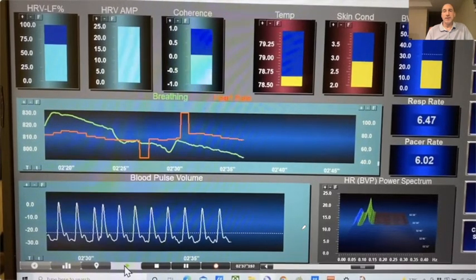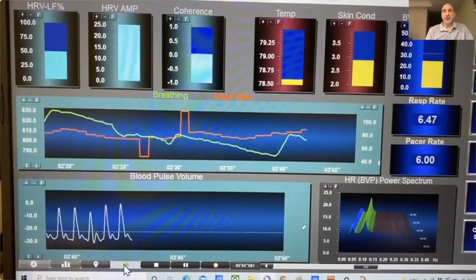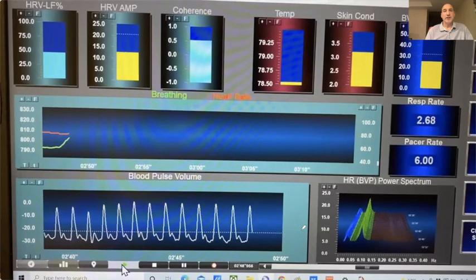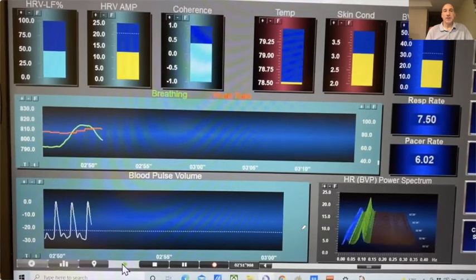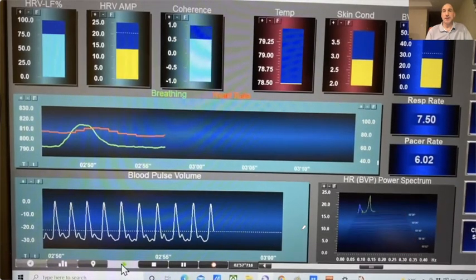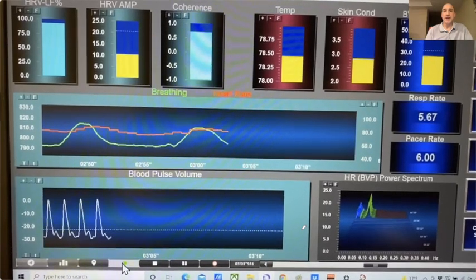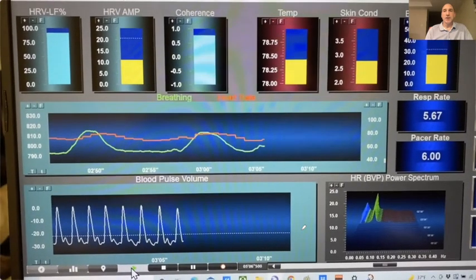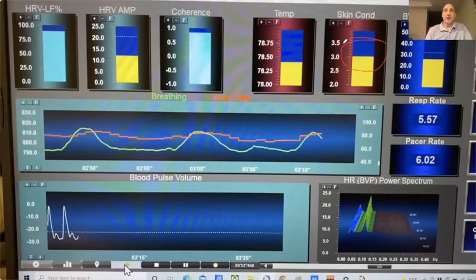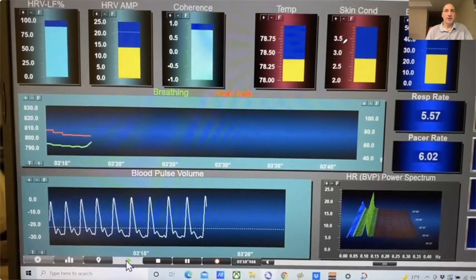And we notice they fall off their breathing rhythm, their heart rate variability narrows, and the coherence between inhalation and exhalation has dropped away. There's almost no coherence between the two, which means the sympathetic and parasympathetic are not having a strong relationship to the cardiac system right now. And so the autonomics are in distress. And temperature falling here, we see hitting a peak in skin conductivity. Again, stress response, a slight sweating.